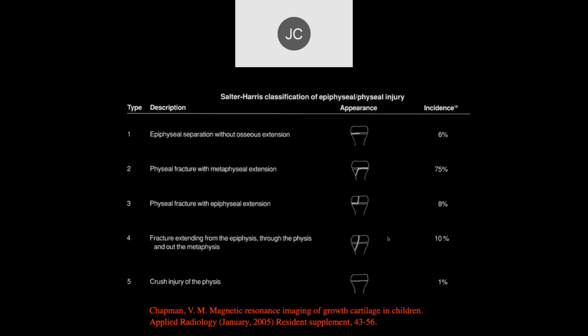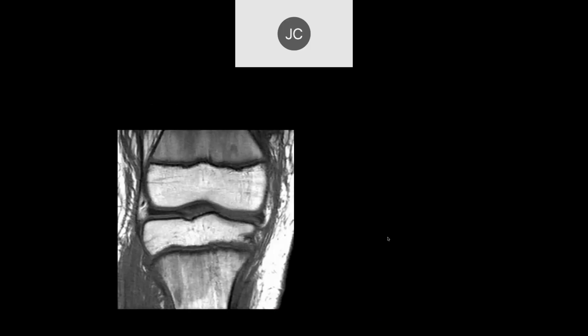It's a torque, and only one area is injured. Okay. And this one is a crush injury. Okay. Thank you. And the other one is not a crush injury, so it's a torque injury. Okay. Thank you. But it's definitely in the literature, John.